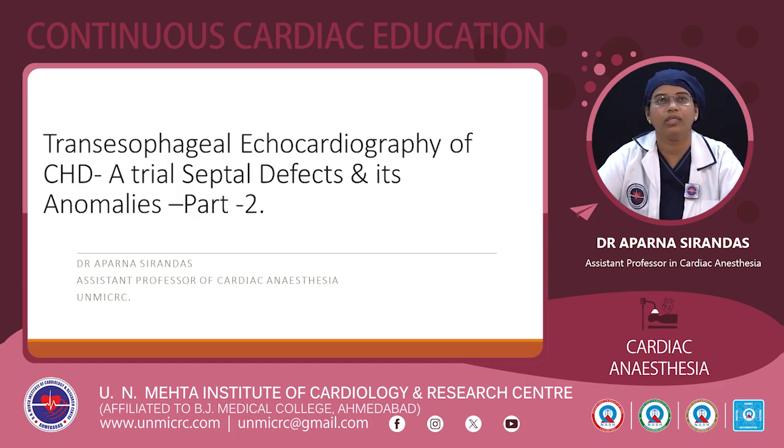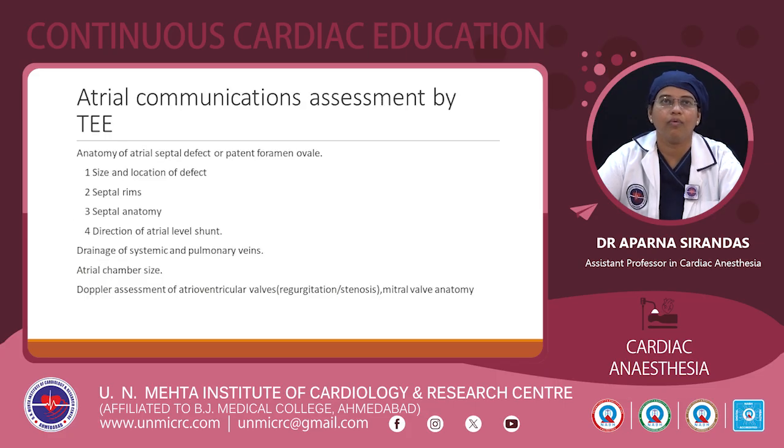Today I am going to present about Transesophageal Echocardiography of Congenital Heart Disease, that is regarding Atrial Septal Defects and its Anomalies Part 2. So what we are going to discuss is atrial communications assessment by TEE.